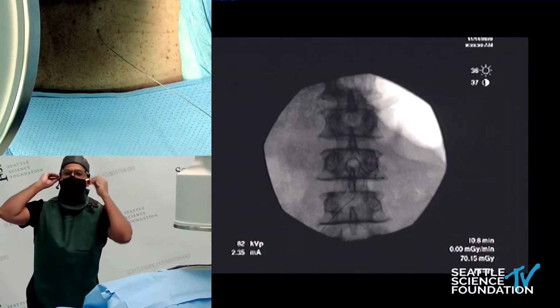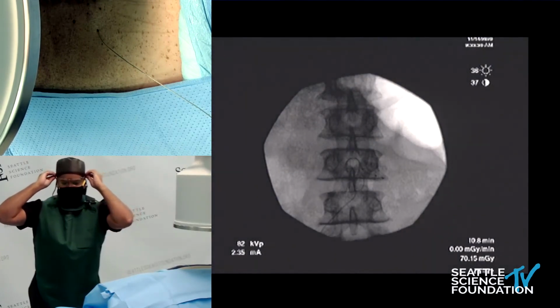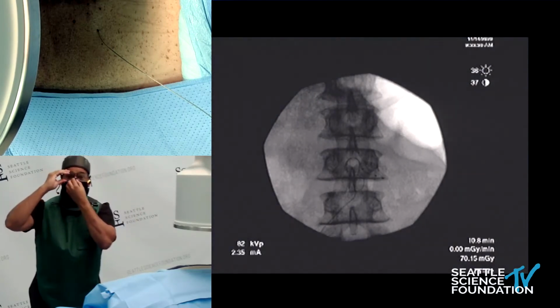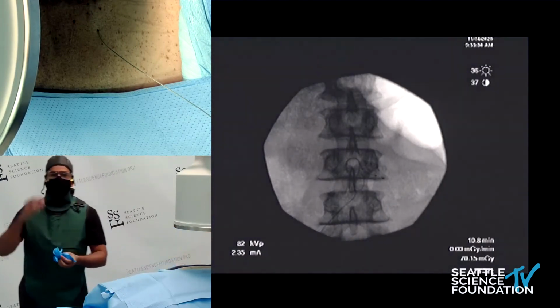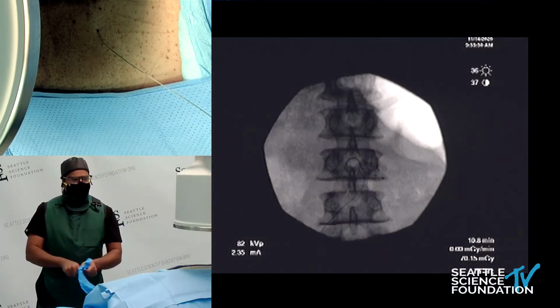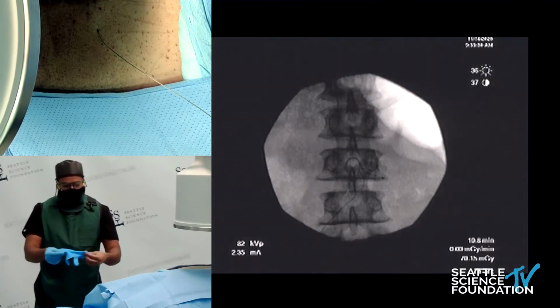In some cases, particularly with a wheelchair-bound patient, like in situations where you have spinal cord injury, some patients should have it in the abdomen just because you don't want that IPG to create an ulcer. So a lot of considerations to take into account when you think about your IPG placement. For this particular patient, we'll just place it in the upper buttock on the left side.